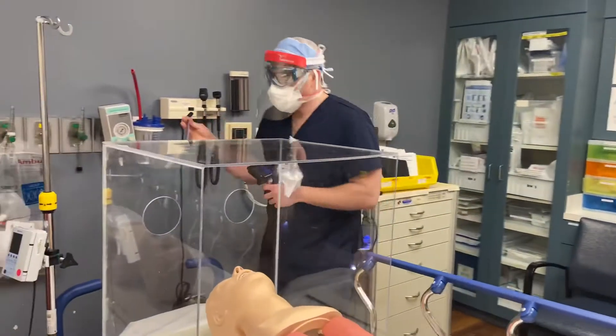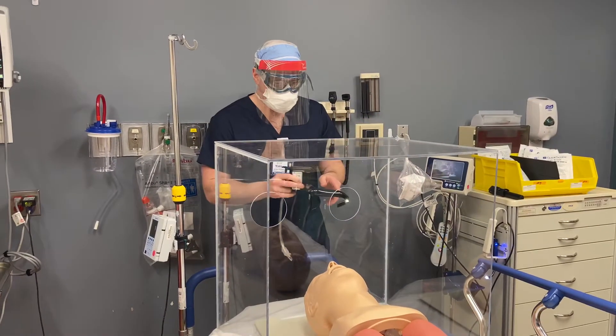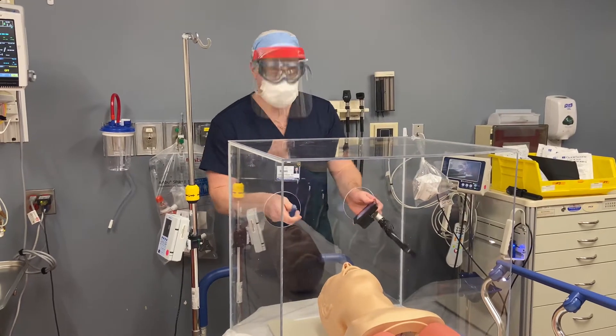So you have your rigid stylet, which is kind of a key to this. I've got my box here, my sim dummy, and there are only a handful of things that I really want to highlight.